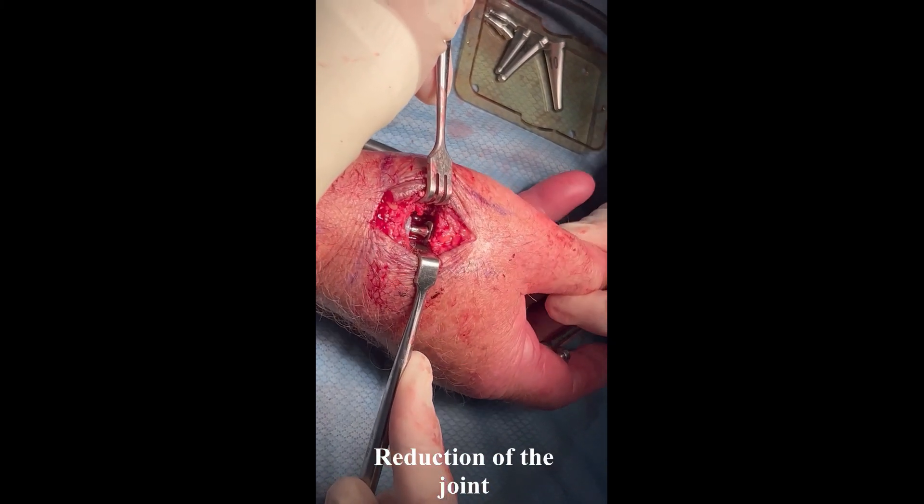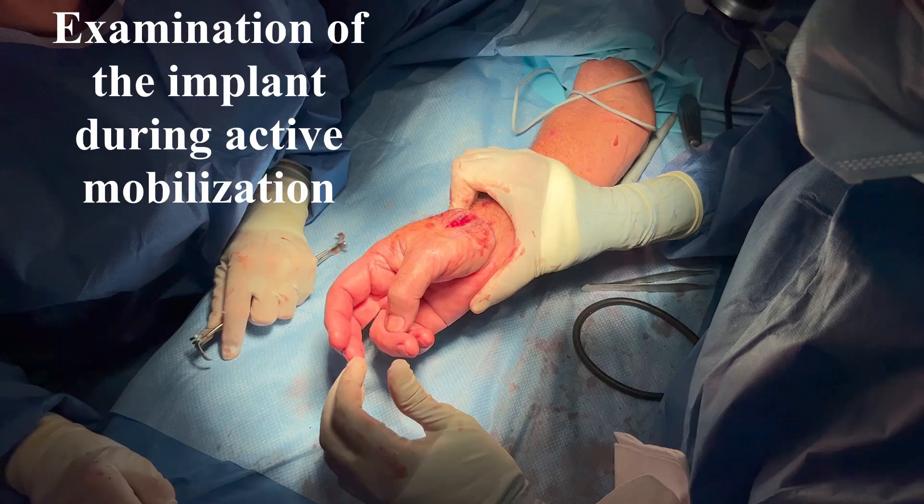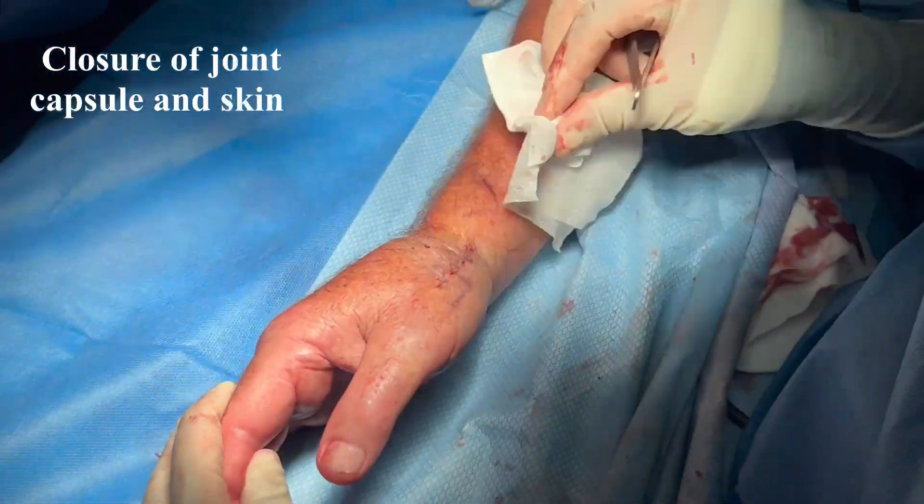Passive and active mobilization are critical to assess for stability and impingement. The joint capsule and the skin are closed.